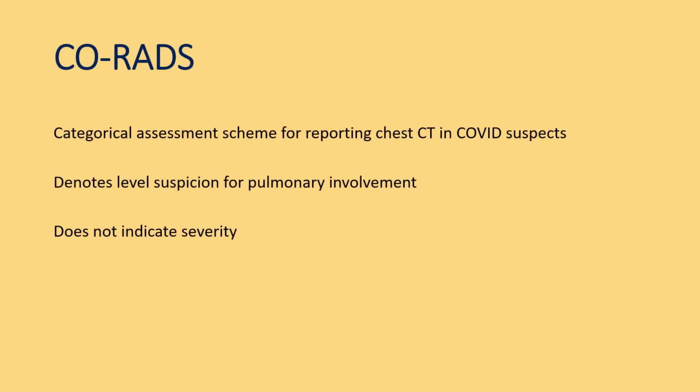The Dutch Radiological Society came up with a categorical assessment scheme for reporting chest CT in COVID suspects. CO-RADS scheme denotes the level of suspicion for pulmonary involvement. It does not correlate with clinical severity.